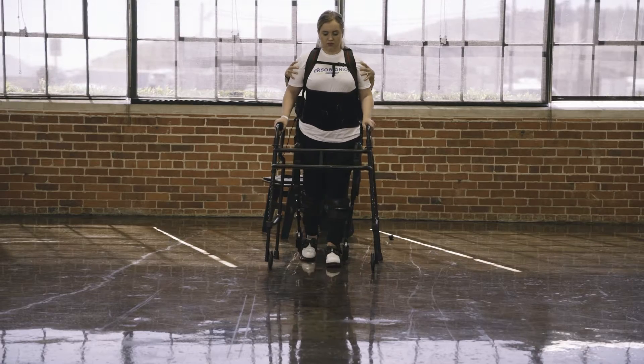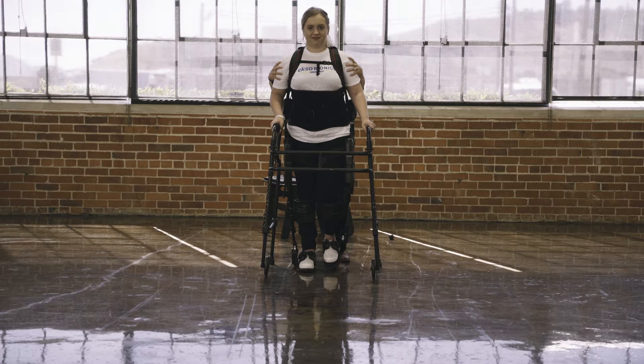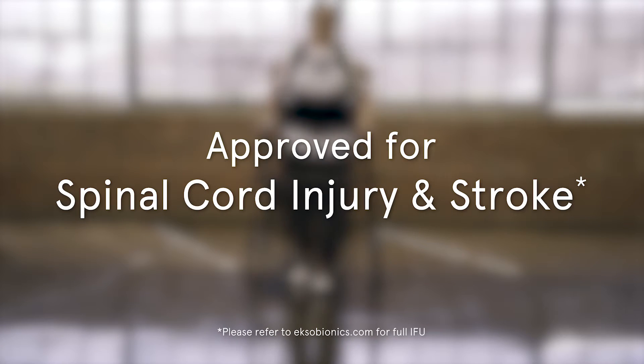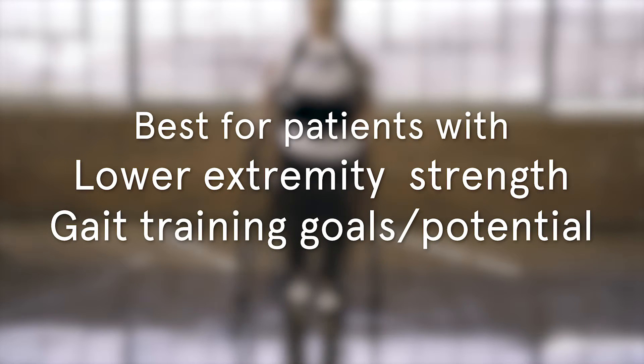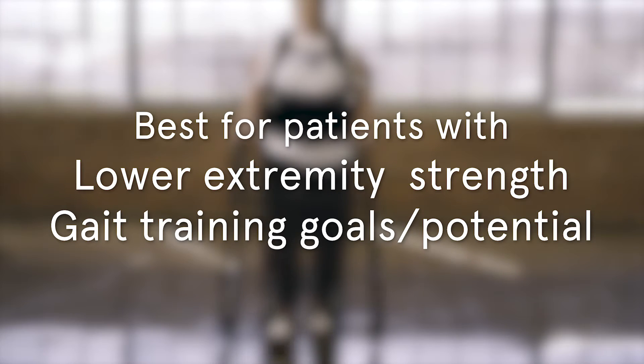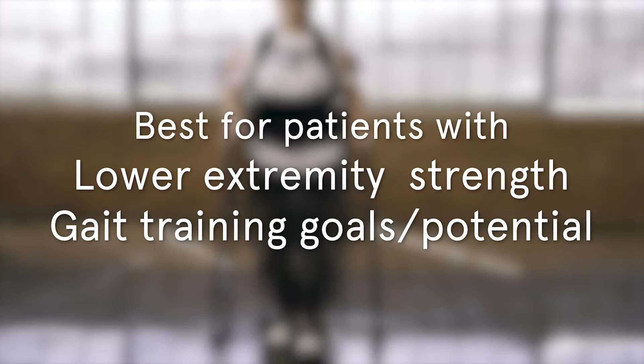EXO-GT addresses gait retraining goals through patterning, stepping, and providing only supplemental assistance when a person needs it. EXO-GT is approved to be used with individuals who have had a spinal cord injury or a stroke. The best candidates for using the dynamic nature of EXO-GT have some lower extremity strength and gait training goals and potential.